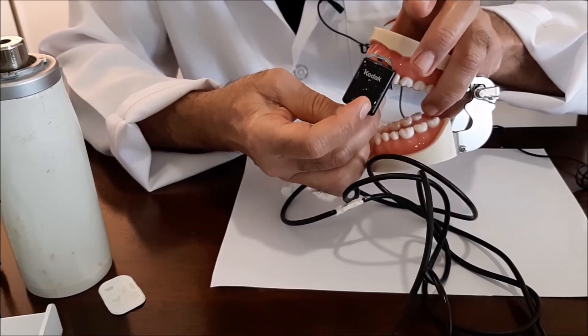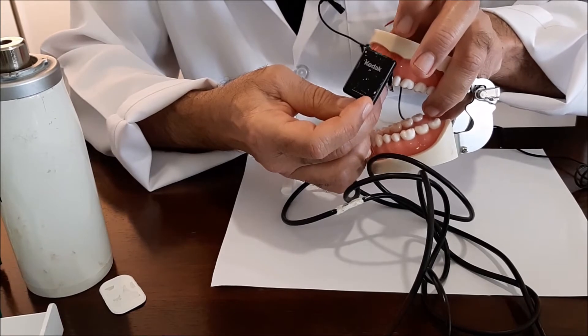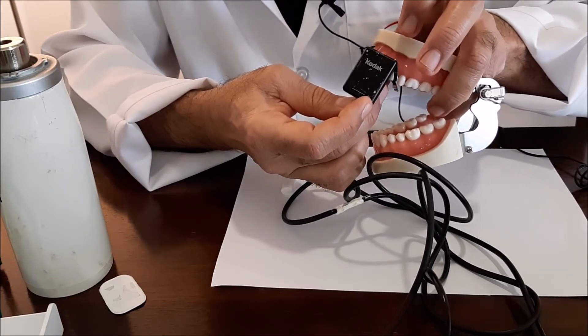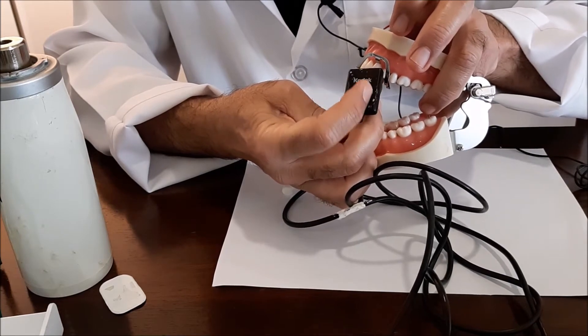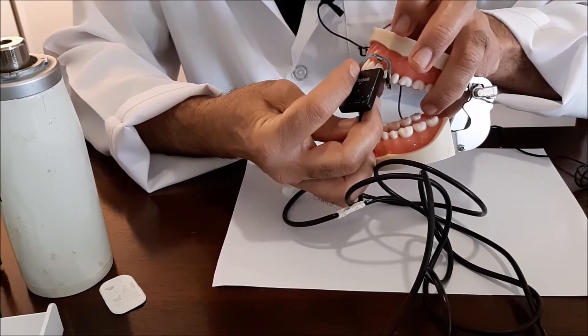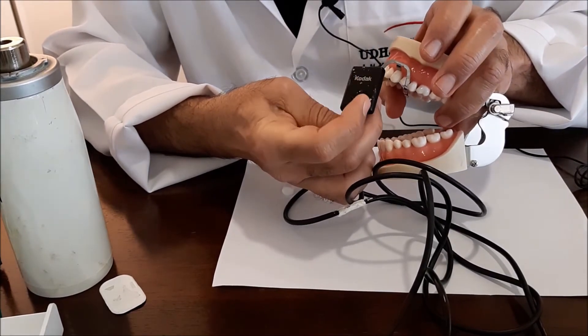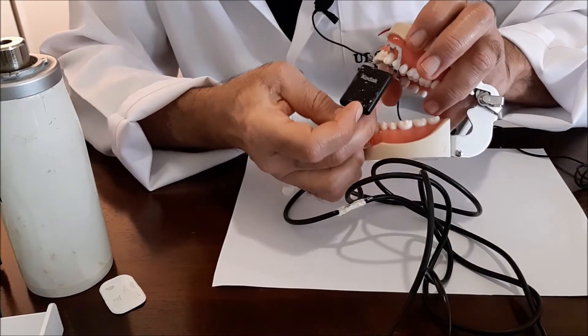It means instead of placing the sensor just exactly behind the canine, you place the sensor this way, so that the canine will be at this dimension of the sensor.